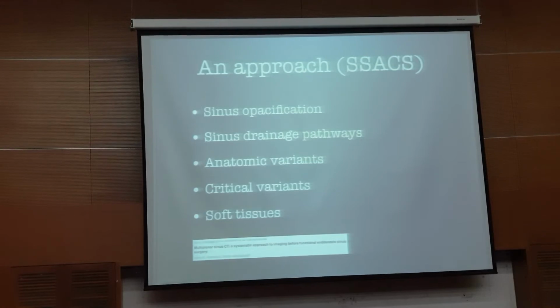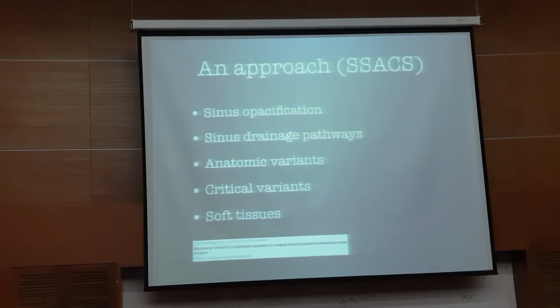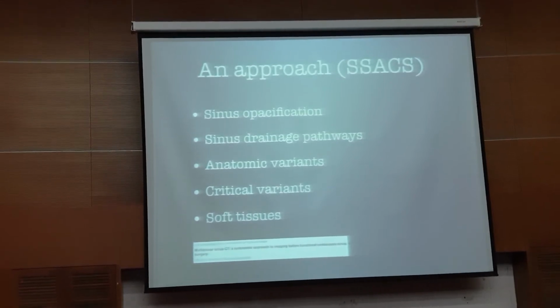Now again, I need to explain to you that when you all become famous surgeons, you probably need to educate your radiologists on how to look at these things. To be honest, paranasal sinus CT among radiologists is not taught very well sometimes in our syllabus, and prepare yourself for this, a lot of them will just report pansinusitis.